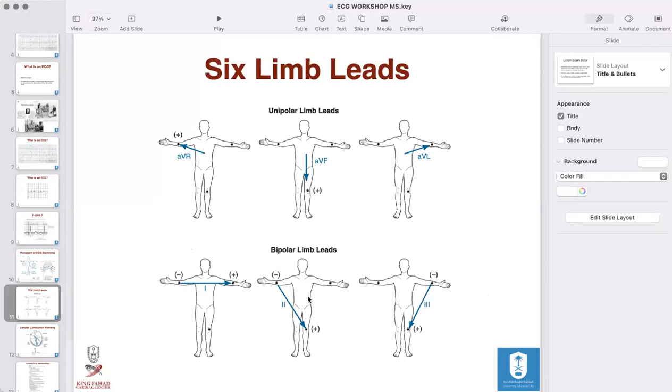And when you do the ECG by yourself, you understand when you have a misplacement of a lead, it's going to show in your ECG. And that's why it's very important, because if you have false information, then you will have inaccurate analysis of the ECG.